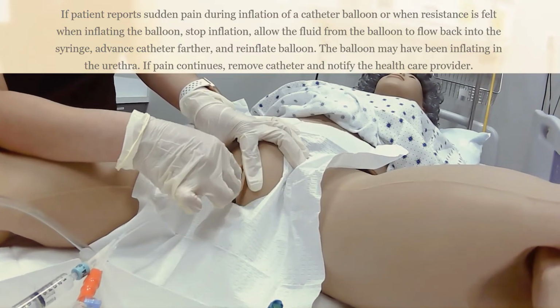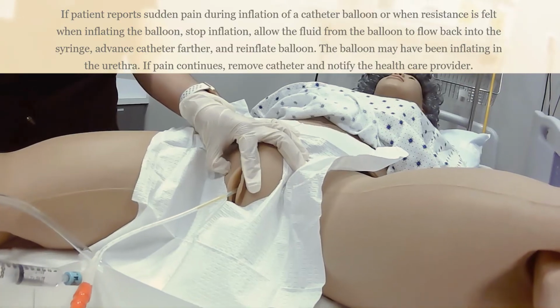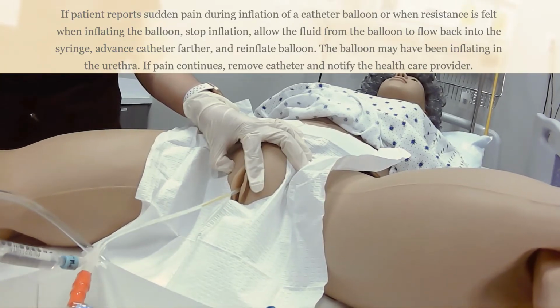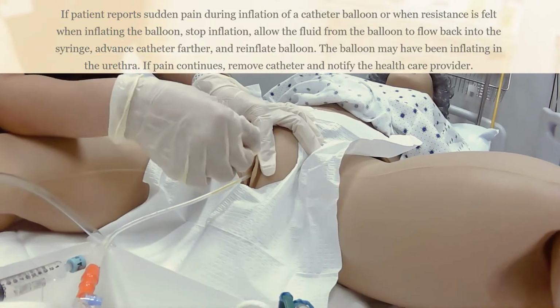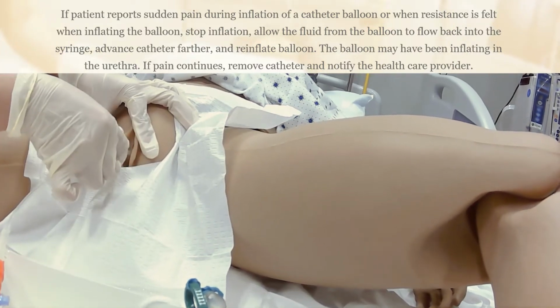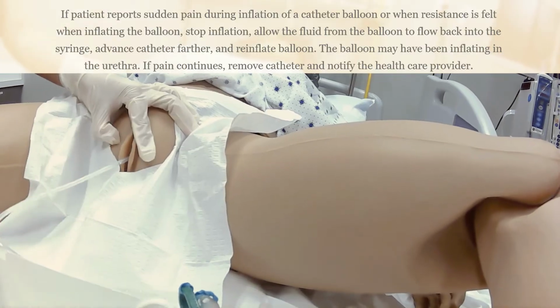So before you insert, you would want to pull out the sterile water from the balloon that you had already inserted. So pull that out, because otherwise you won't be able to further advance the catheter. So we'll withdraw it, we'll aspirate it, and then we'll advance another inch. Okay, so when we do that, we'll try it again.